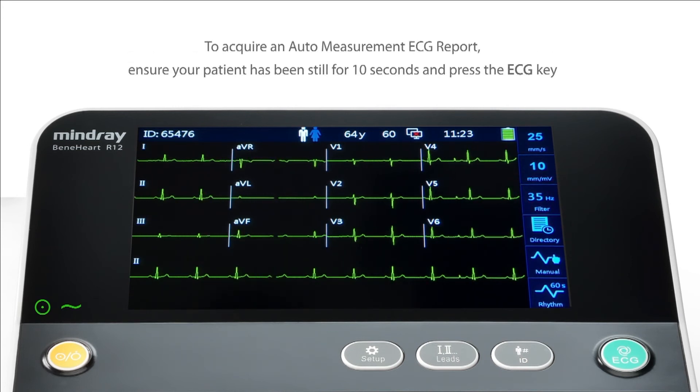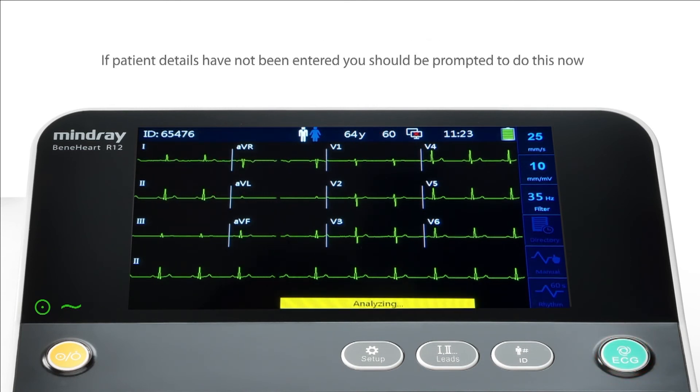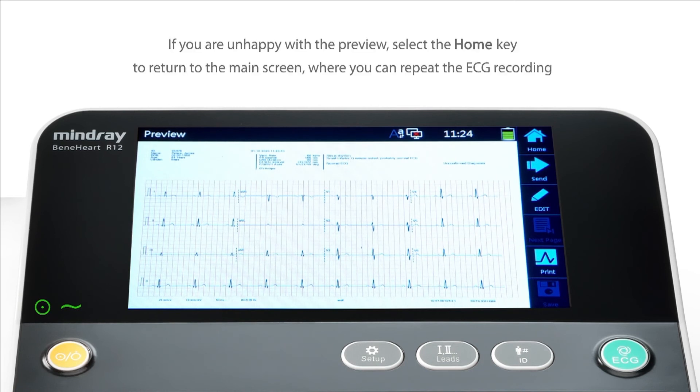To acquire an auto-measurement ECG report, ensure your patient has been still for 10 seconds and press the ECG key. If patient details have not been entered, you should be prompted to do this now. The device will generate a preview for you to check the ECG quality. If you are unhappy with the preview, select the Home key to return to the main screen, where you can repeat the ECG recording.